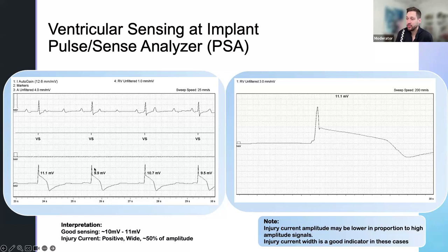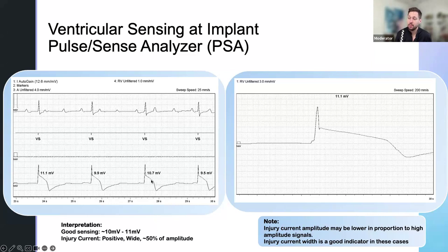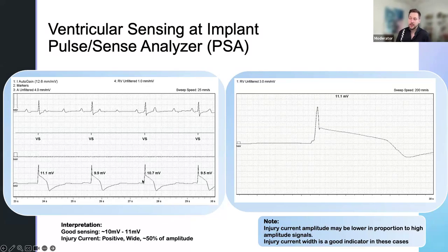Good injury current — it's positive, which is fantastic. It's wide, which we love to see. It's 50% of the amplitude. If you have a very high amplitude signal, your injury current could reflect as less than it really is. So if you have a 20 millivolt signal and the injury current is only five millivolts high, that's still a good injury current — it's about half of the QRS. We're not necessarily looking for the height of the injury, especially when you have a tall signal. We're looking for this widening of the QRS or widening of the EGM QRS.